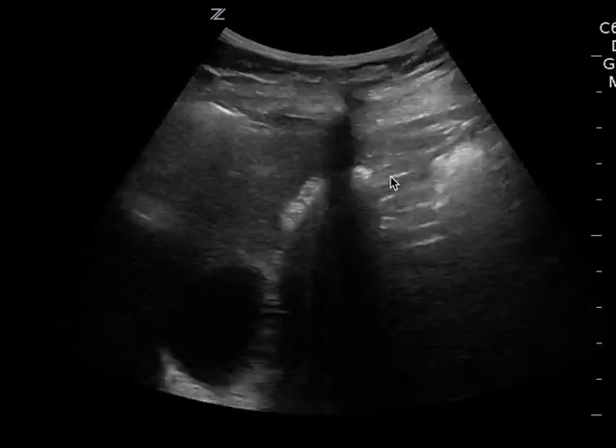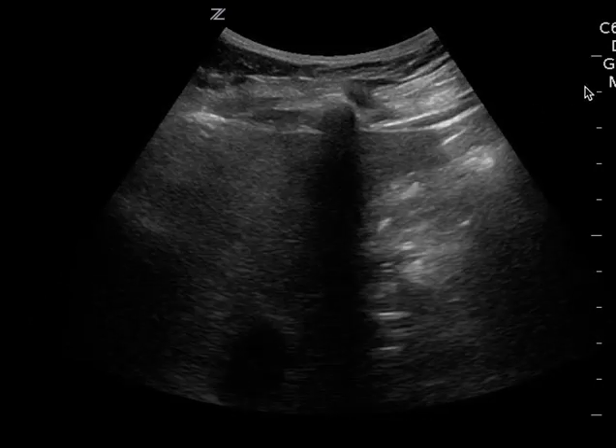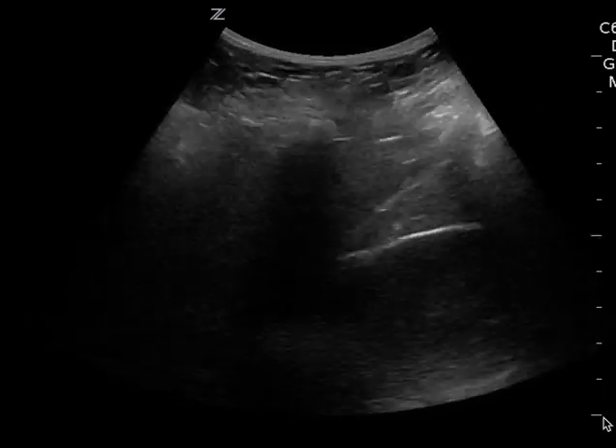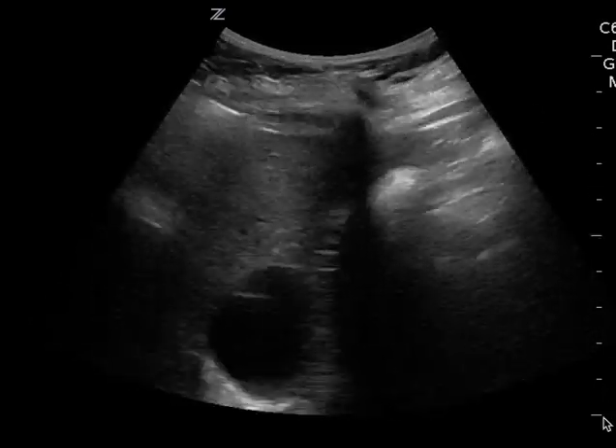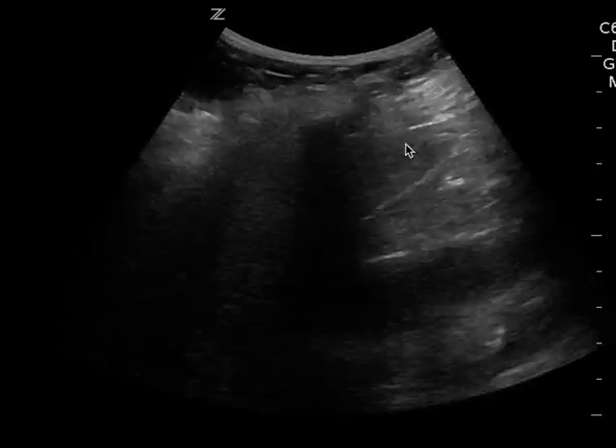This is a FAST exam and this is your right upper quadrant. I want to make this video to illustrate that your depth is way too superficial. It's safe to 10 centimeters, but you probably need to go to 15 or 18, only because you don't get a complete view of Morrison's pouch.